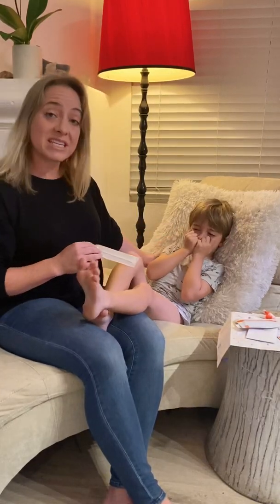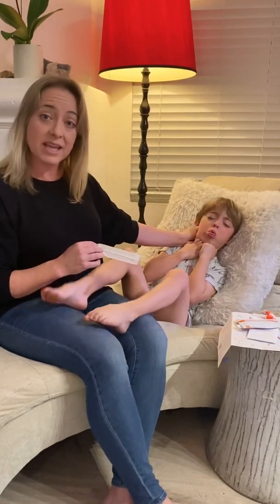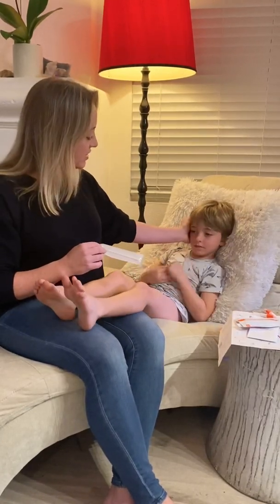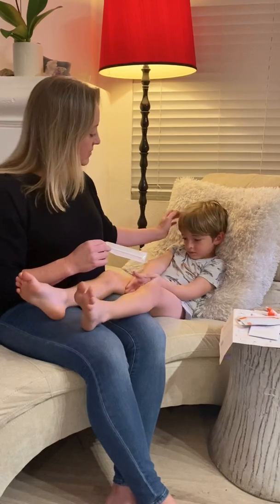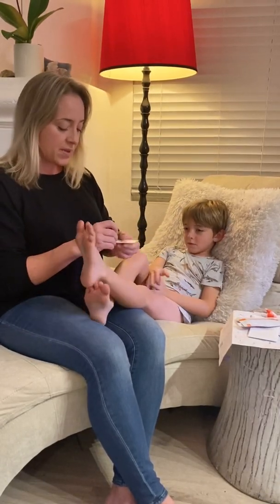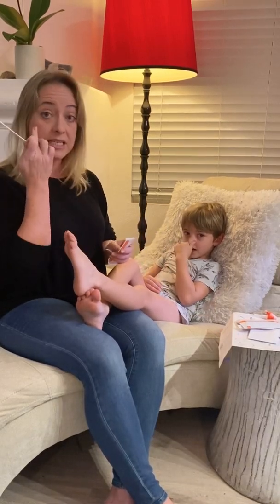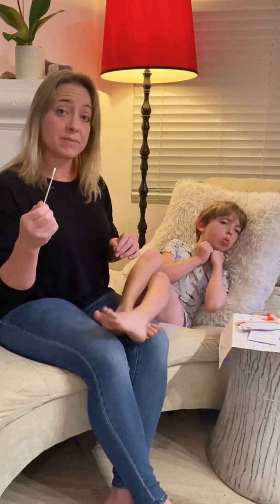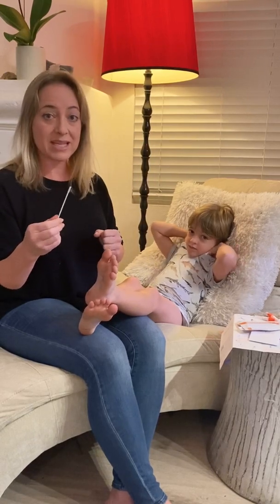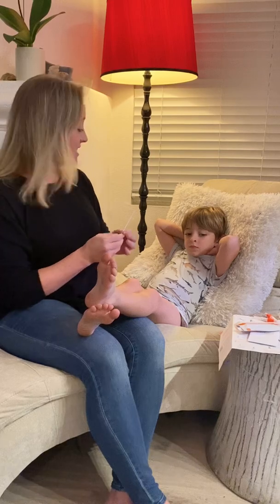We make sure that he's comfortable and aware of what I'm going to do so that he doesn't move quickly and risk hurting himself. The swab is going to need to go three-fourths of an inch into his nasal cavity and we're going to turn it five times. Make sure that your kids don't blow or clean out their nose right before doing this, because you actually want to catch that mucus if it's there.